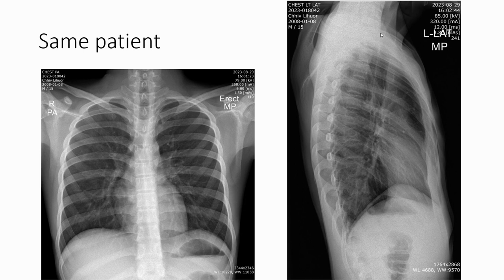And here is his chest X-ray. So there is no sign of metastasis, consolidation, or calcification.